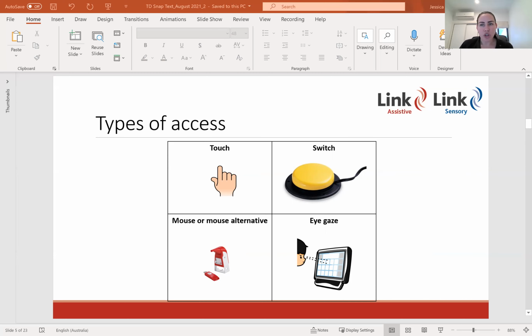And if you wanted to know a little bit more about access and positioning, we do have an introduction to access and positioning webinar that was presented by our OT Jade, and that's available on the recorded webinars section of the website. So you could go there to get a little bit of an intro and find out a little bit more. But basically the TD Snap text page set can be accessed through the whole range of access methods that are currently available.